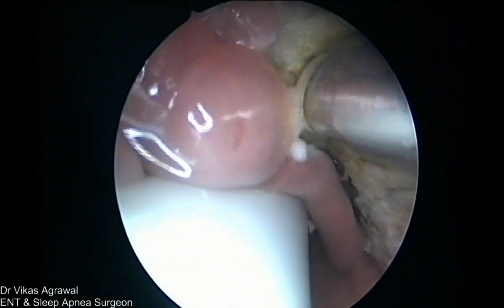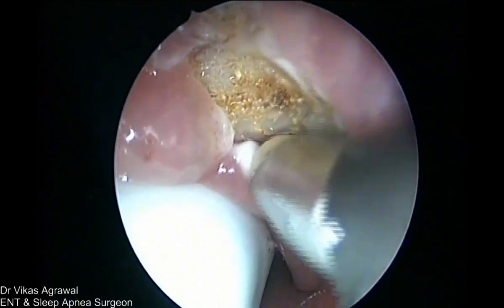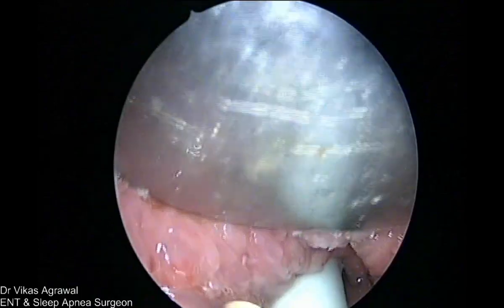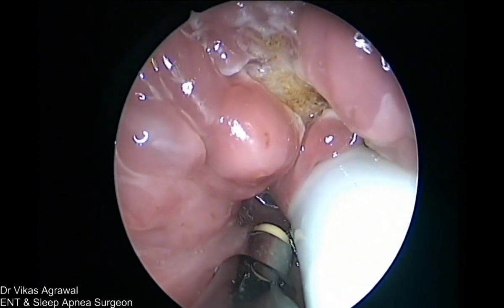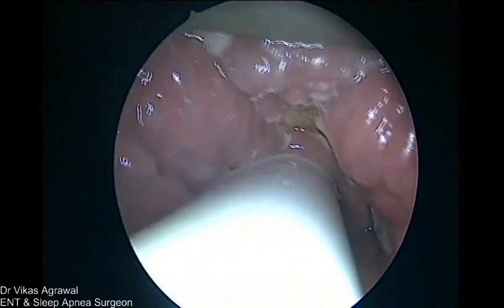In the midline, I am going into the muscle. I'll not go into this surface of the epiglottis. Now we need to keep the tube on this side, because it is a left nasal intubation. Sister, please hold this.